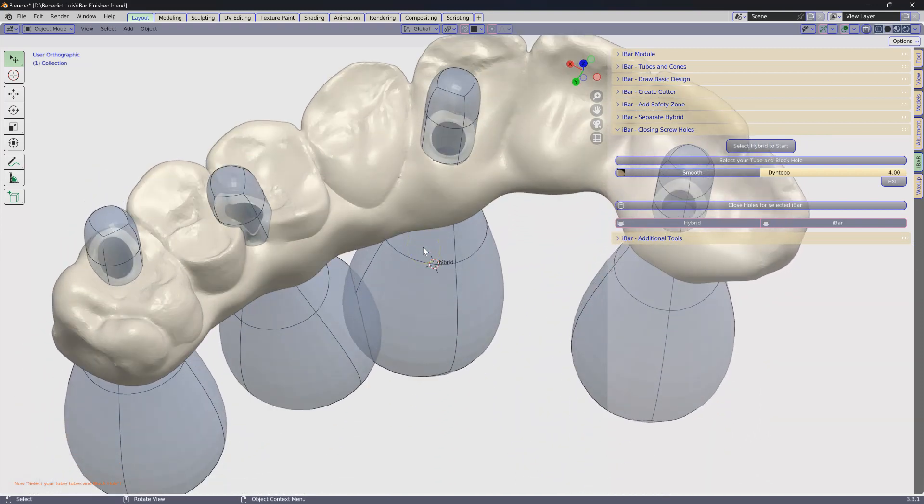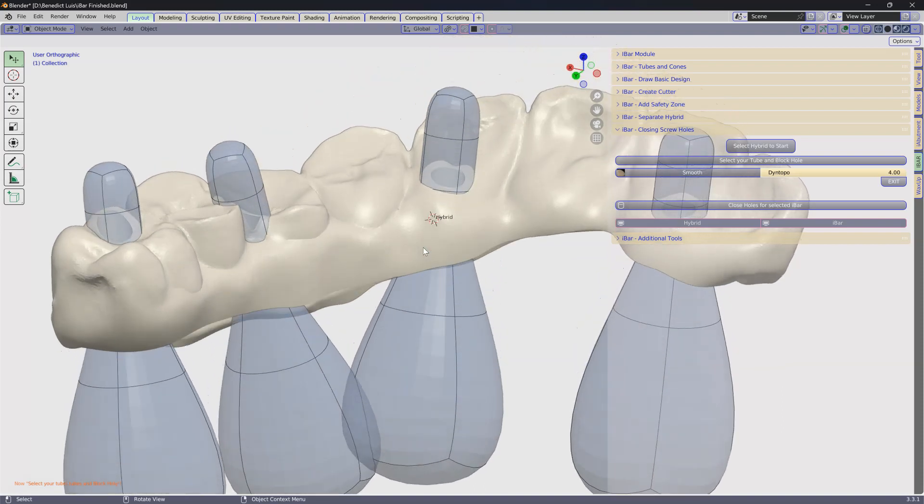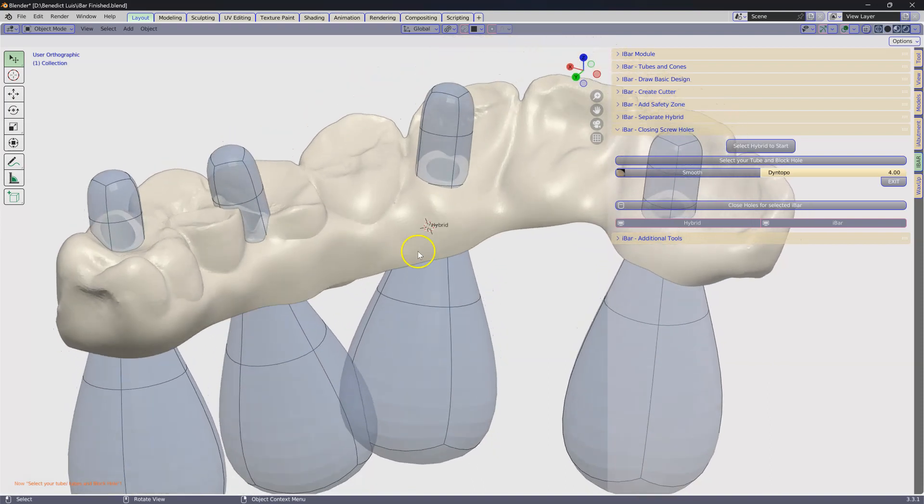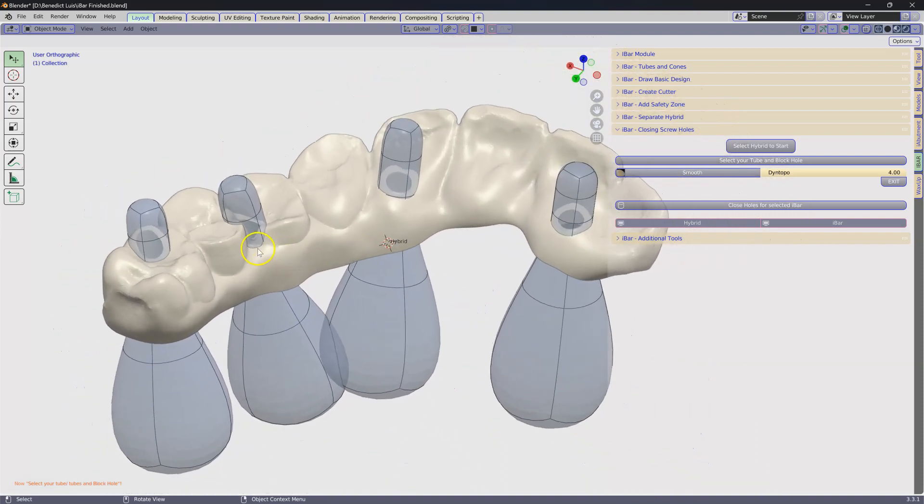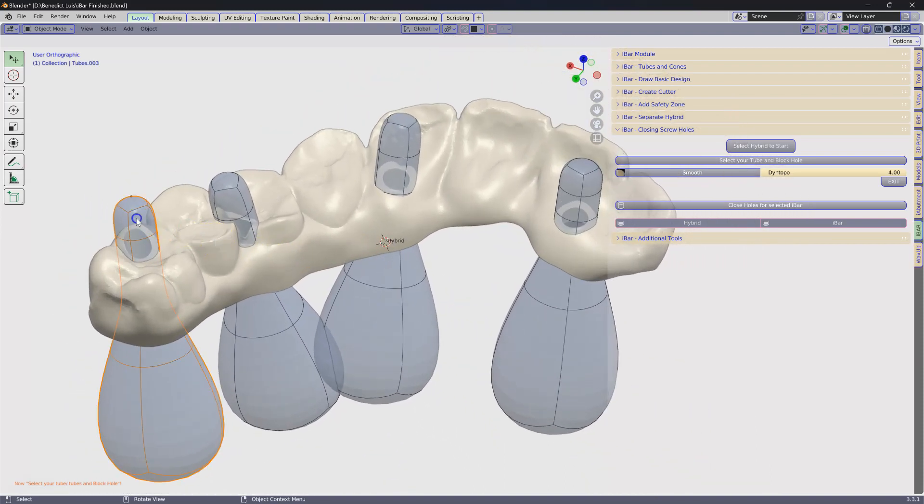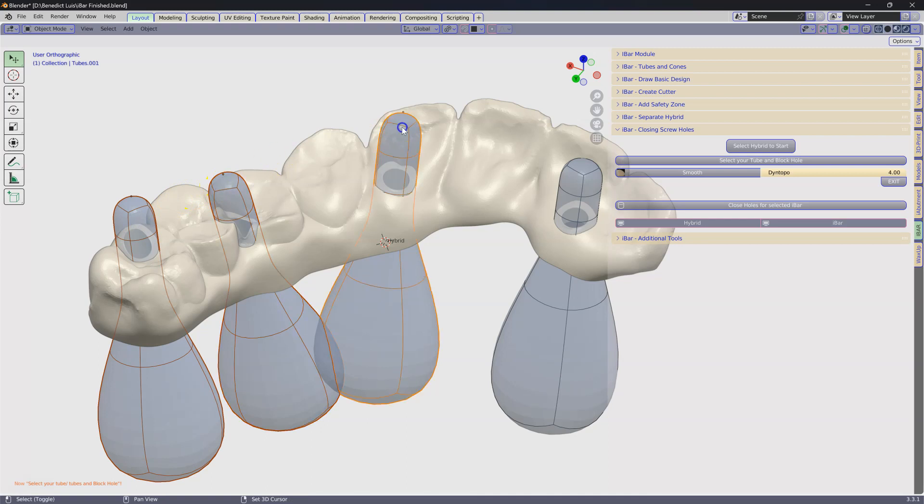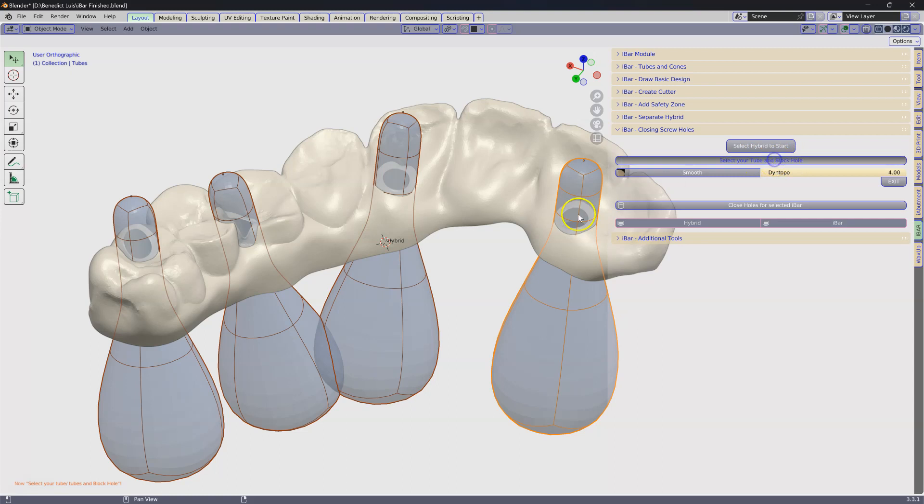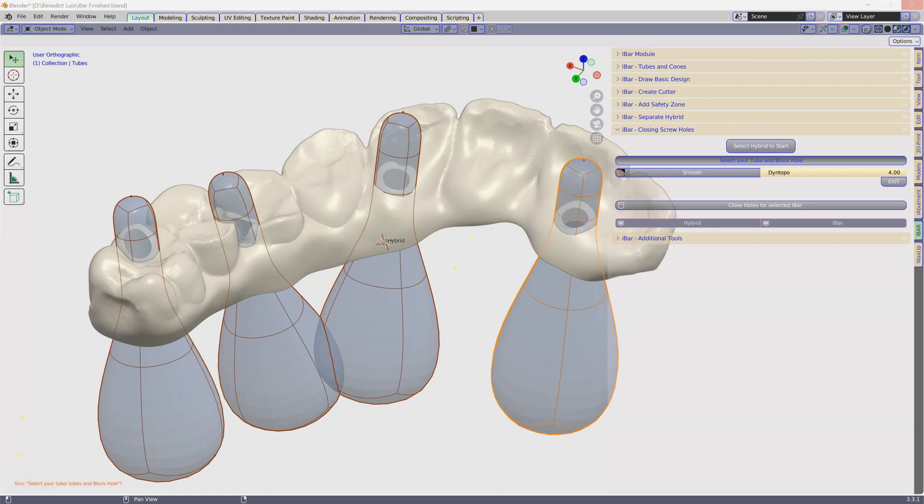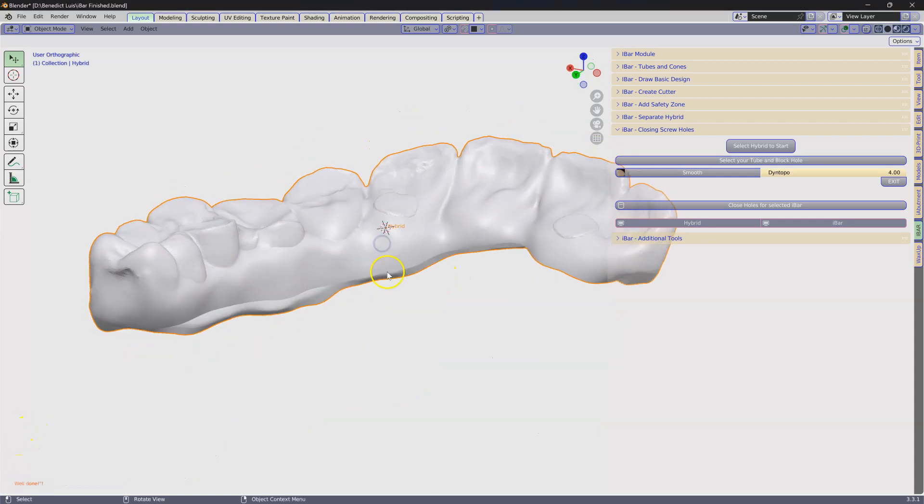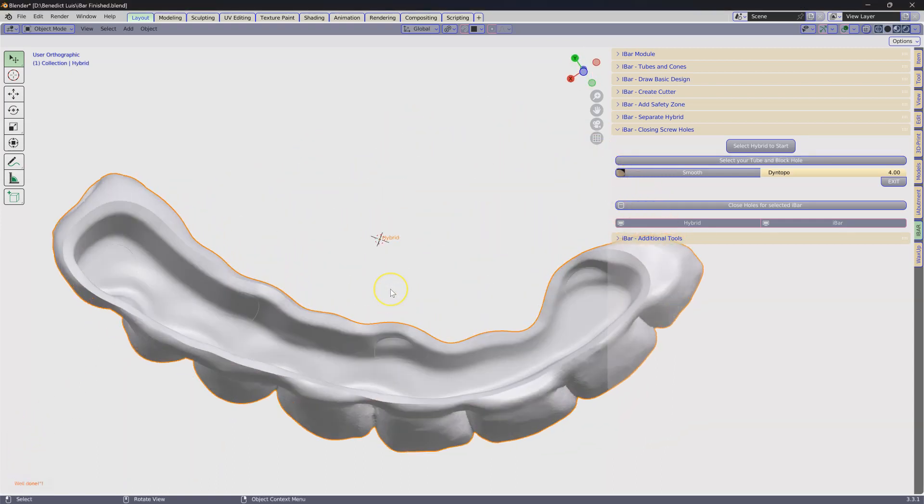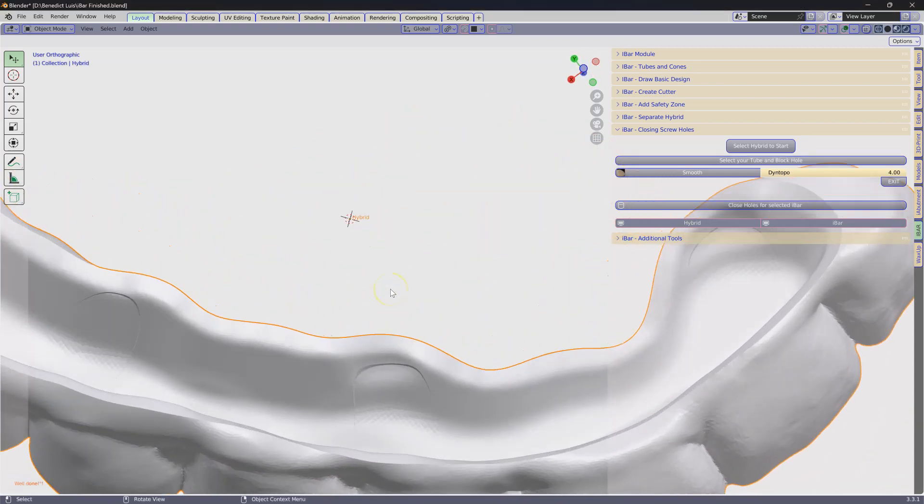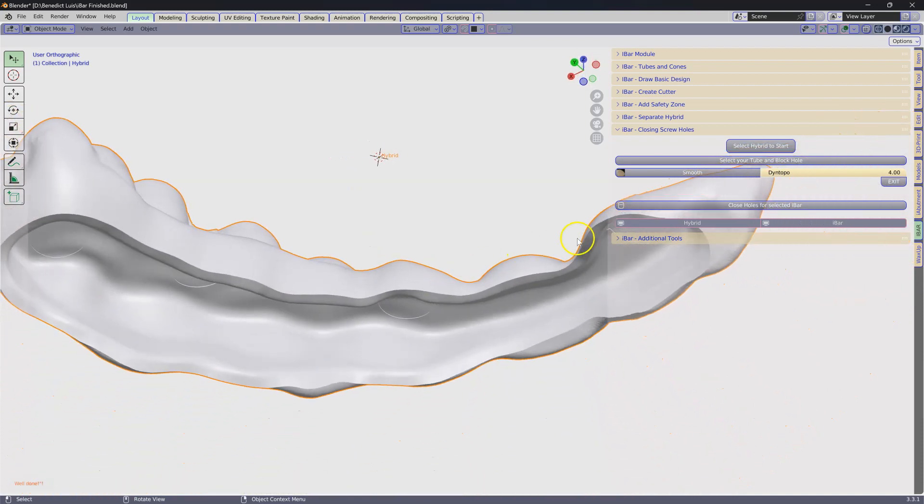These little magic tubes are going to do what we need them to do. Select the holes that you want to block out and then select your tube and block holes. This takes a little while because there's a lot of scripting involved. So that's quite easy. These are all blocked out perfectly.